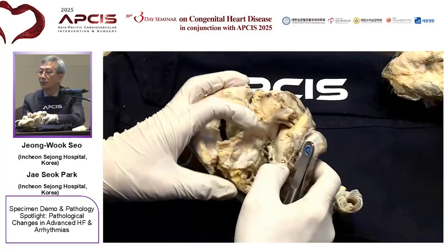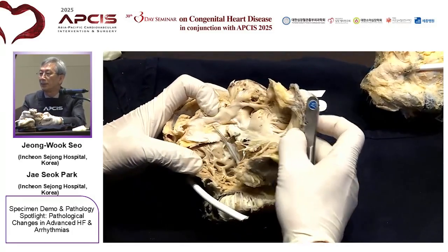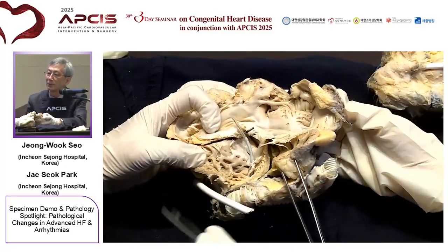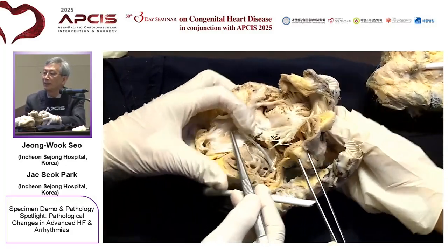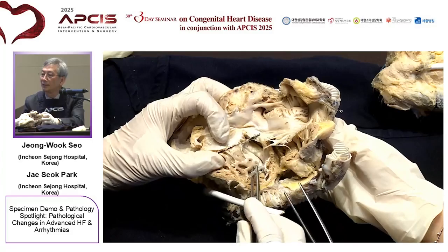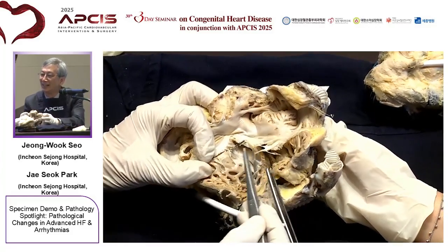So now we will see details of the CSP lead like this. I have shown from the PowerPoint slide that the CSP lead was placed somewhere. This is the ICD lead to the right ventricular apex.